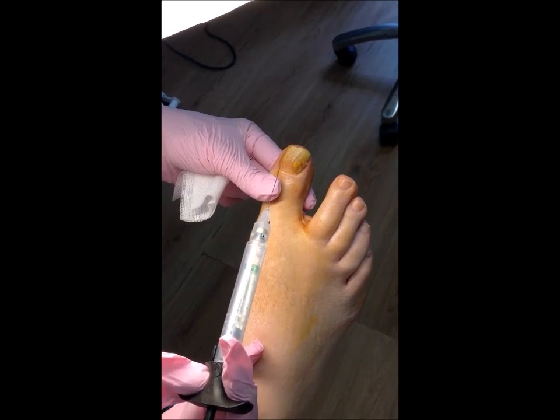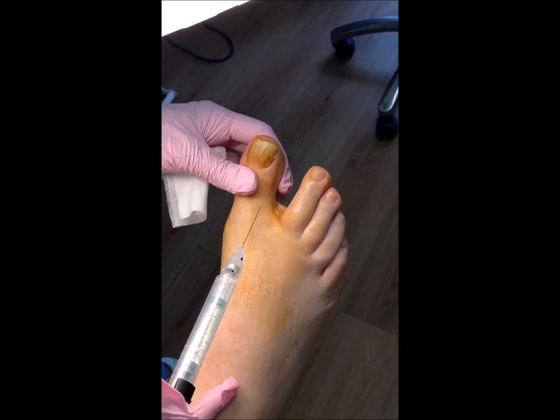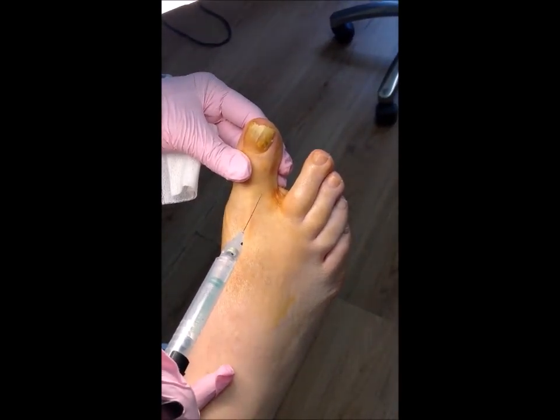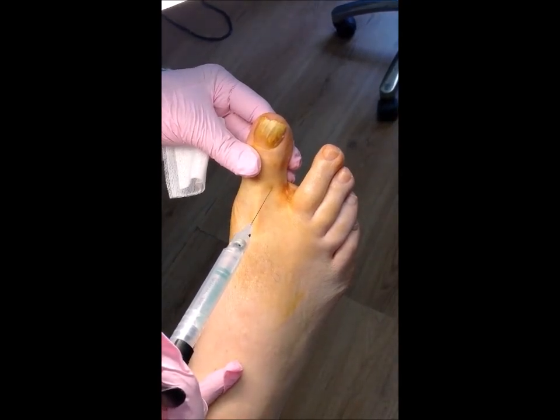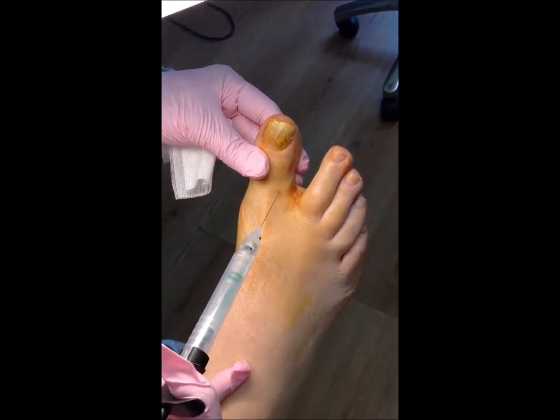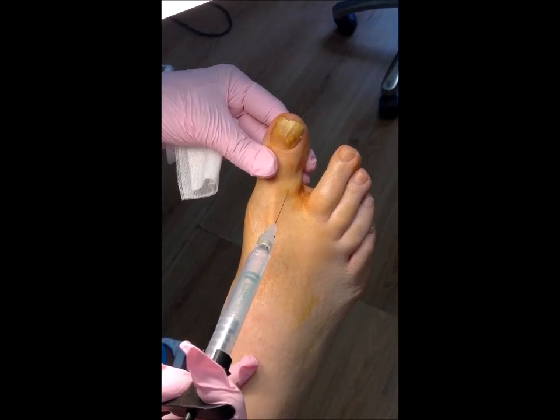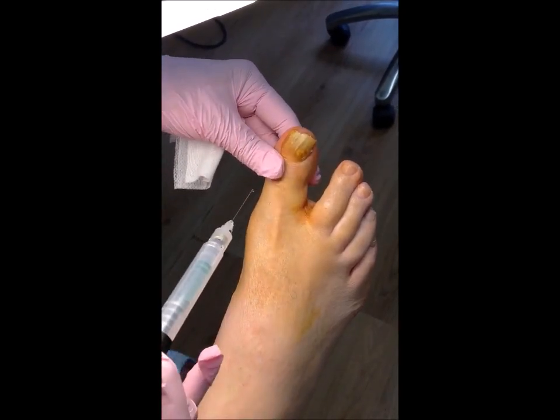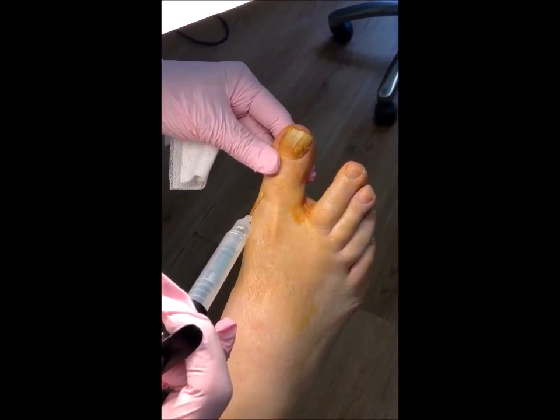First of all, I need to anesthetize this big toe. You are going to feel a sharp scratch here, and for the purpose of this video I'm at a slight angle for the camera. Now when I discuss removing toenails with patients they become very squeamish at the idea, but it's actually a very, very simple procedure.